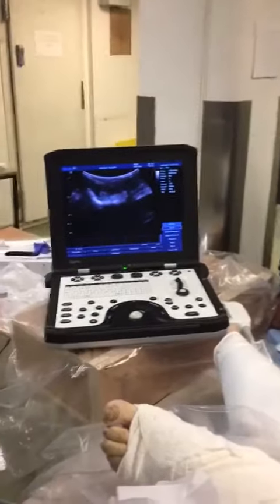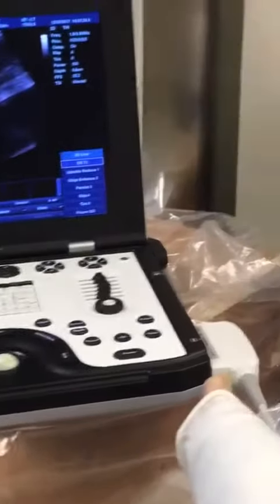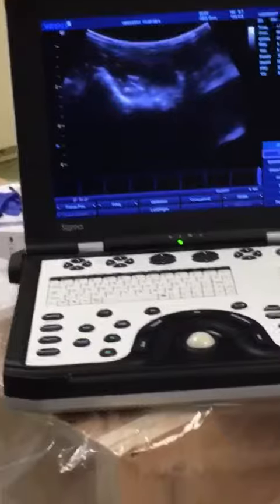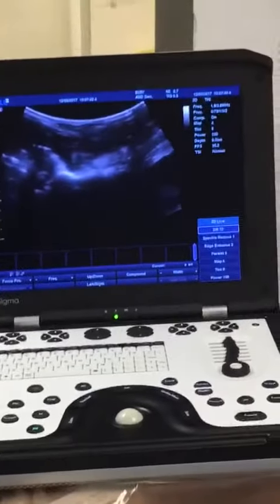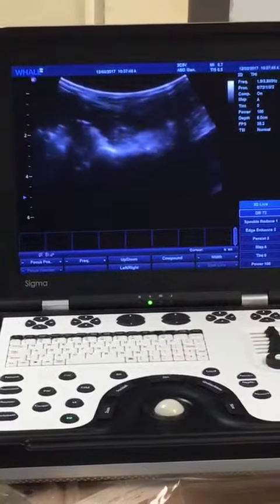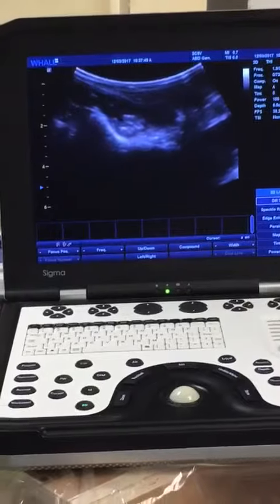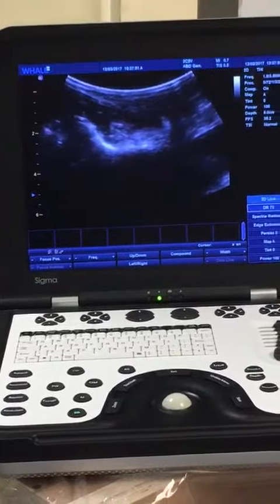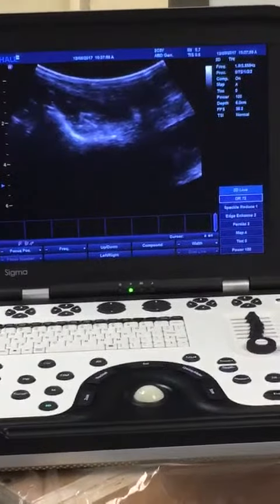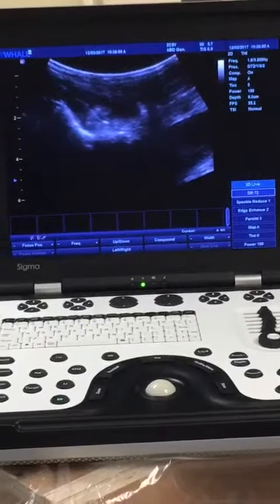Pass me the needle. This is going to be very steep — if I don't go steep I'm not going to be hitting my target. Get that image where you can see the AIIS, anterior inferior iliac spine, the iliopubic eminence, and the psoas tendon. We're going to go very steep, in-plane, in the middle of the probe, and come in.